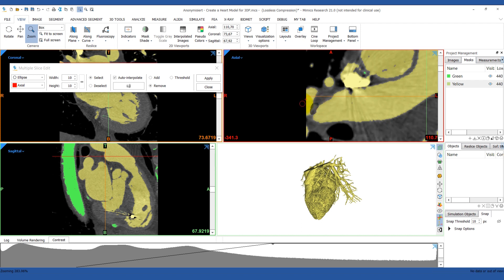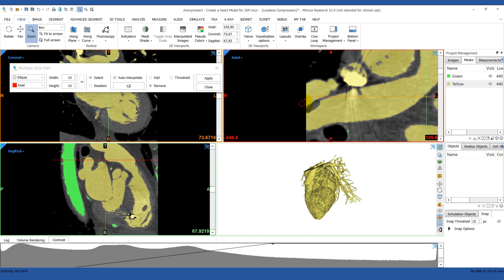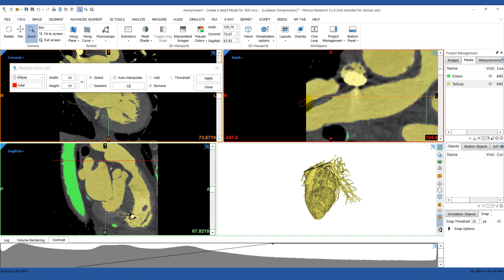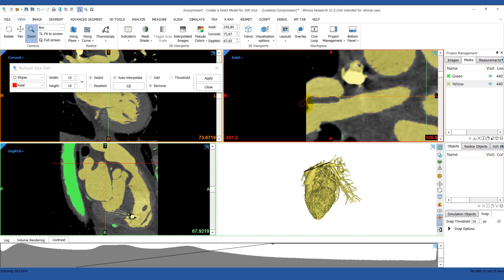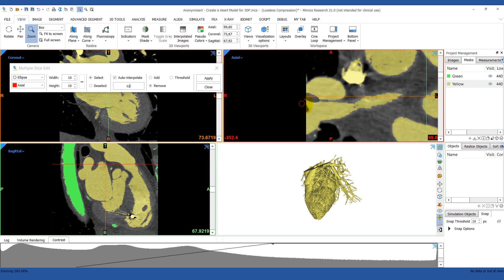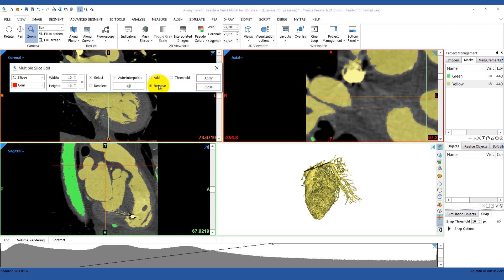When you're done, scroll back through your images to make sure that the markings are correct. If you want to touch up any areas, you can. When you're ready, make sure that your operation is set to Remove, because we want to remove the connection, and then hit Apply.